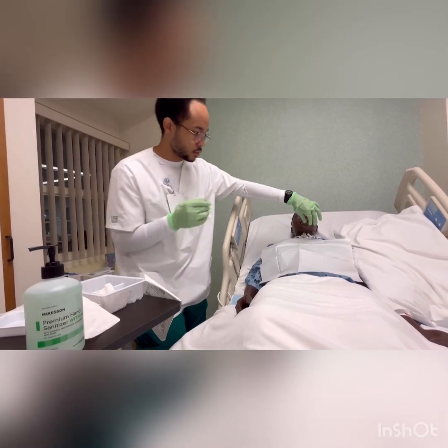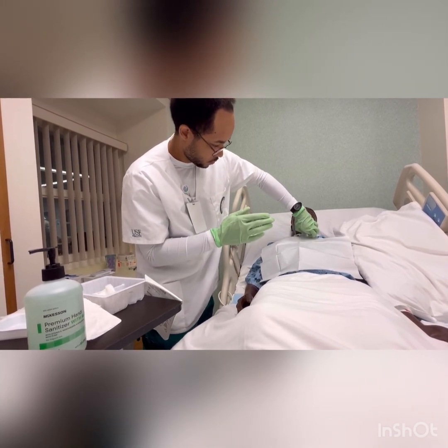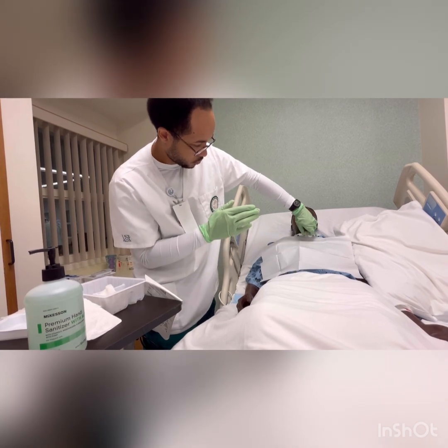Remove the inner cannula as needed with the clean hand. Then, clean the inner cannula as needed, maintaining a clean hand and sterile hand.